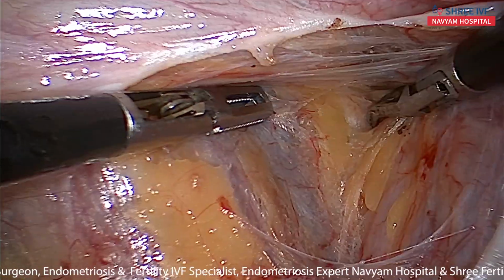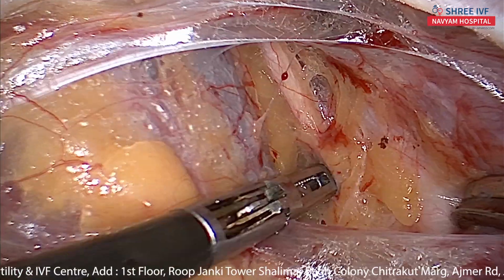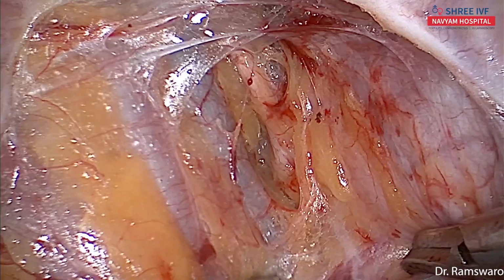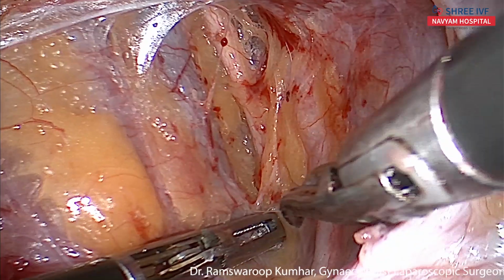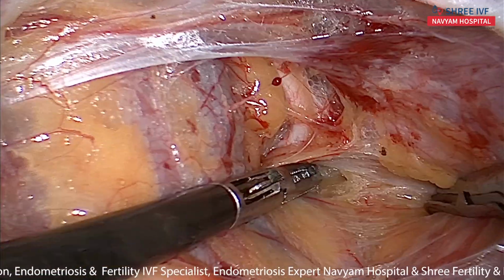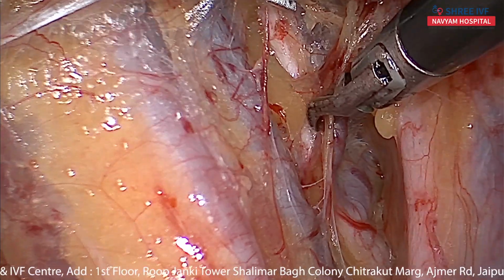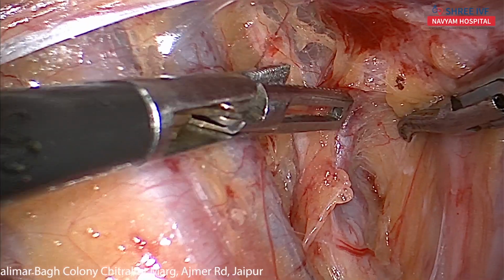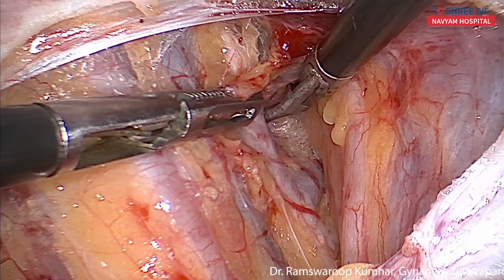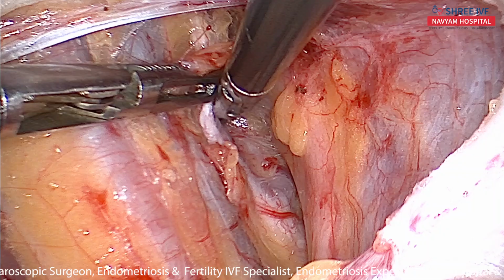Then we'll go further, and the next structure will be the uterine artery at its origin. This is the internal iliac artery going further, and blunt dissection is good. The first tortuous structure, bluish in color, will be the uterine artery. So we will hold this artery and dissect it for at least 2 centimeters of its part. Then we will coagulate it.